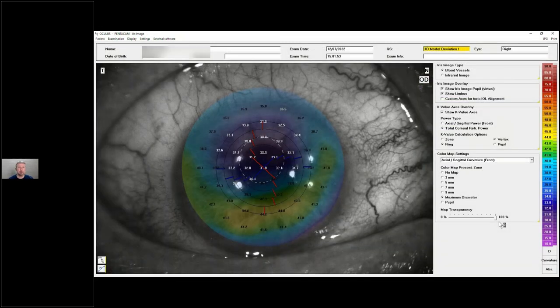The final display I'll show is the iris image. We can remove the topographic display to see just the cornea, the entire anterior surface of the eye, and the iris. Or we can overlay topography and adjust the opacity. This is especially useful for patients who've had LASIK — you can see this patient's ablation zone is decentered superiorly, and it's just easier to visualize this way. It's also helpful if there are pinguecula or pterygia that might become an issue for fitting scleral lenses.